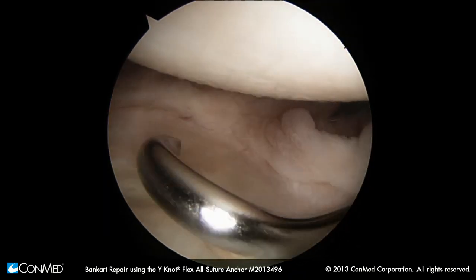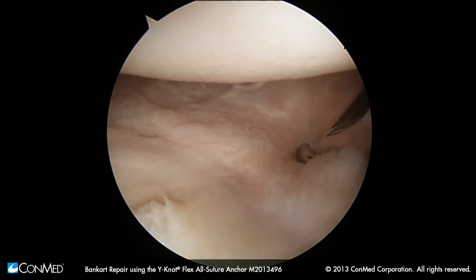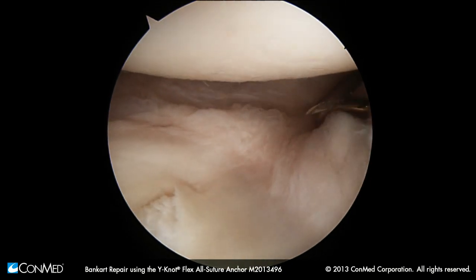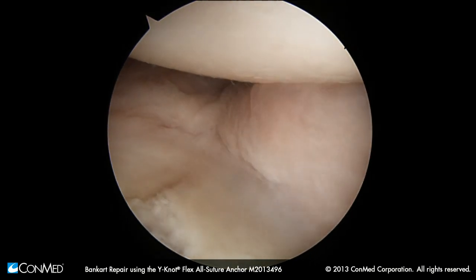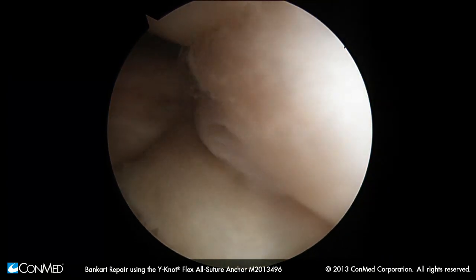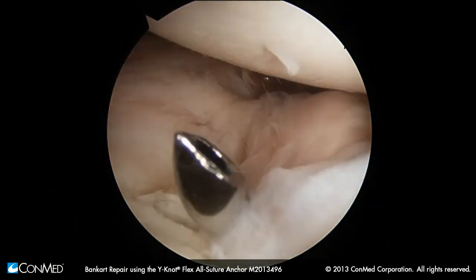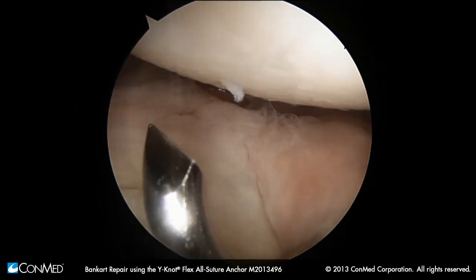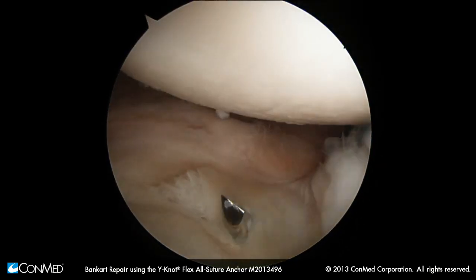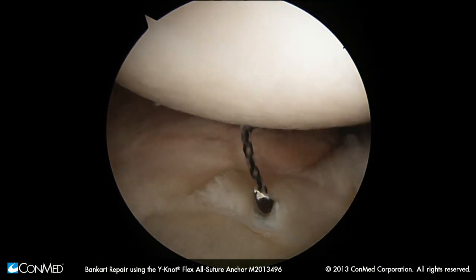We can get our pinch tuck here perpendicular, heading down, just saying hello to the axillary nerve, and then coming back in without taking a huge bite. There's no way that our axillary nerve is going to be in there. We've tried to get axillary nerves with this stitch in cadavers and we're never able to do so. However, use caution down there. Here's our pinch, and then we can probably also get a reasonable pinch tuck through this labrum, at which time we would send our shuttle through and pass a stitch.